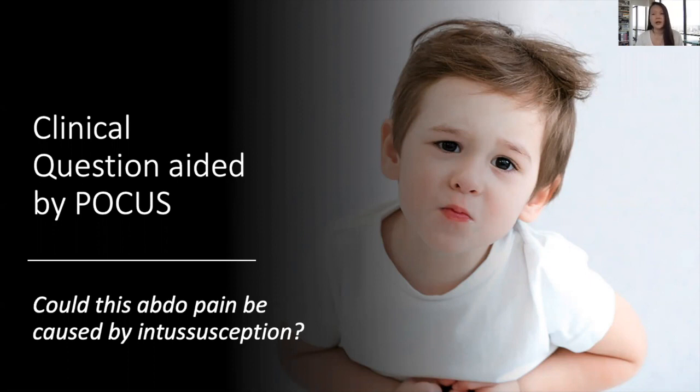Now we all know that constipation is a clinical diagnosis, and we definitely don't need to POCUS every constipated kid, but the scenarios where it may be helpful are the toddlers who are coming in with abdominal pain, and then on your further history have a few soft red flags, like maybe they have episodic leg pulling, or the crying is more intense than you would expect. And depending on where you work, radiology may not always be readily available. So in those cases, POCUS can help you risk stratify and figure out next steps.